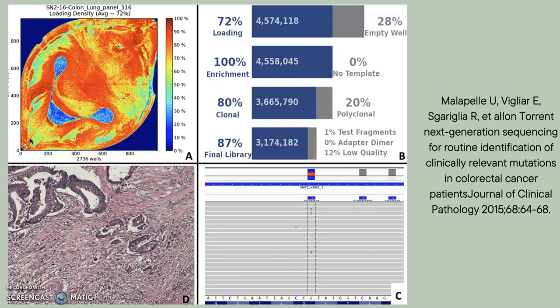Sanger sequencing is currently widely used to look for genotypes like KRAS and BRAF in colorectal patients. So in this paper, the researchers verified the Ion Torrent panel and applied it to specimens using Sanger as a reference. The results were that the Ion Torrent could detect mutant levels at 5% and classify control tissues and detect mutant alleles that Sanger missed. So this figure is showing those results.